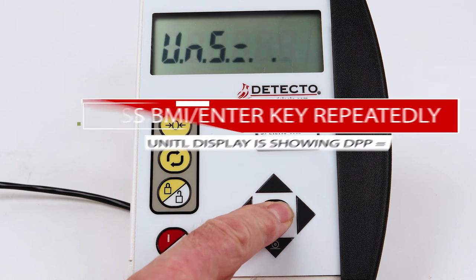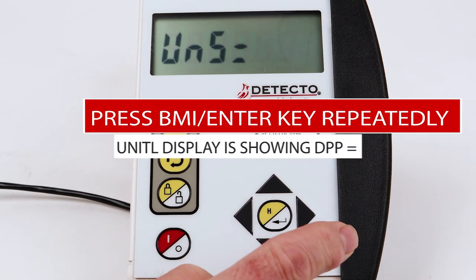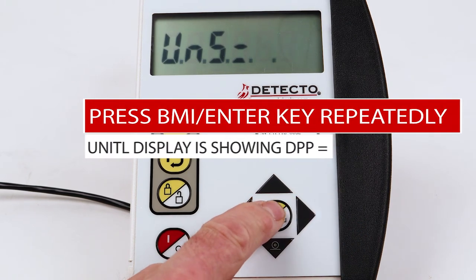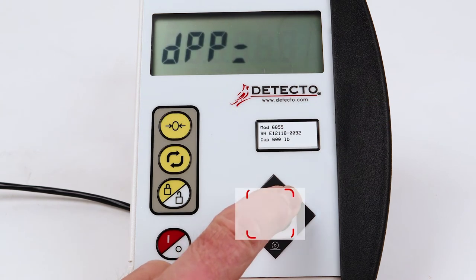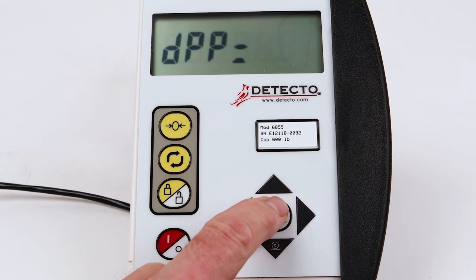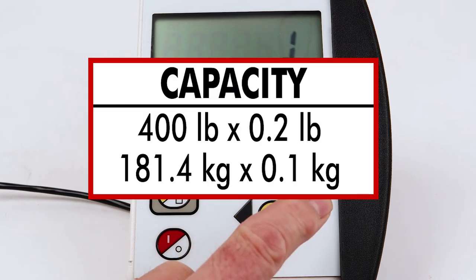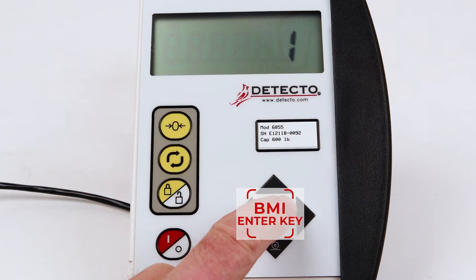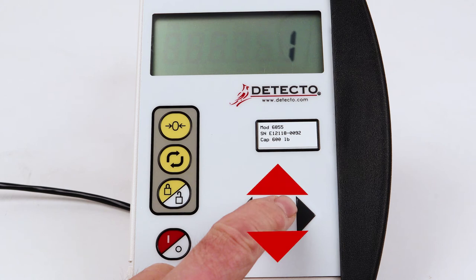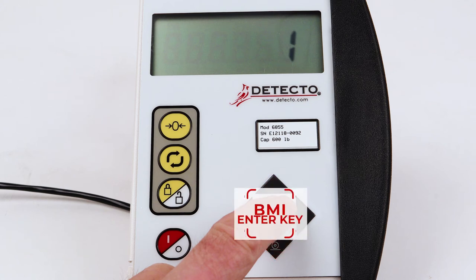Press the BMI Enter key repeatedly until the display is showing DPP equal for the decimal point position setting. Press the BMI Enter key to show the current setting. If the setting is the same as the decimal point position from the label or serial number tag — it will be 0, 1, 2, or 3 — press the BMI Enter key. Otherwise, press the up or down arrow keys to select the correct decimal point position and press the BMI Enter key.